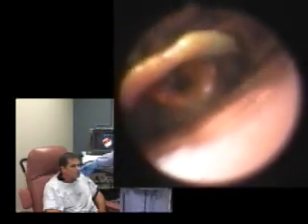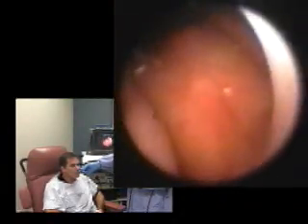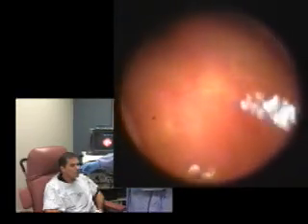Relax. Very good. So if you have a patient that may have some deglutive problem, you could have them do a mini Valsalva and then swallow. By doing that, your cord is very well protected. I think we are almost done here. Coming back into the nasopharynx, base of the skull straight through. You have the eustachian tube opening, and this side coming into the nasal cavity and exiting. Very good. Excellent job. Thank you.